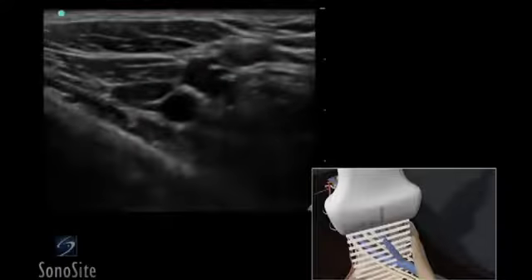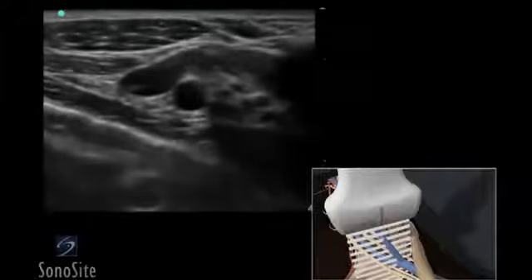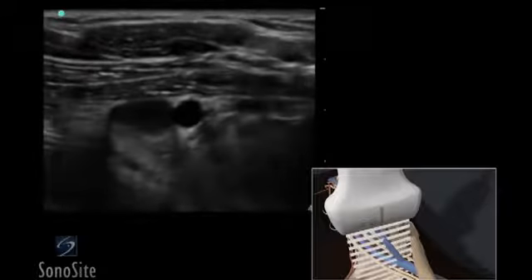A linear array transducer with a nerve exam type is used to perform an ultrasound-guided infraclavicular regional nerve block. The target depth is approximately 3 to 4 centimeters in an 80-kilogram adult.